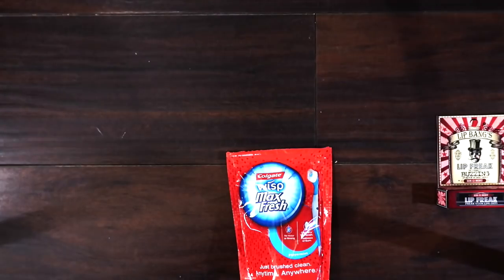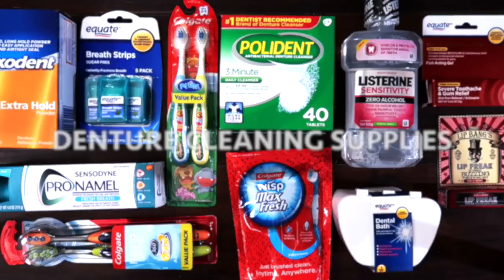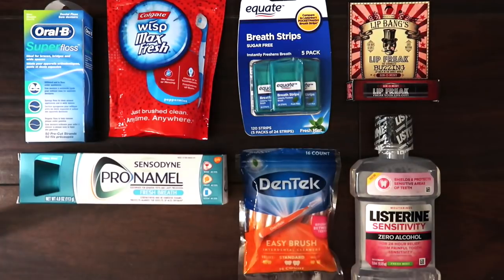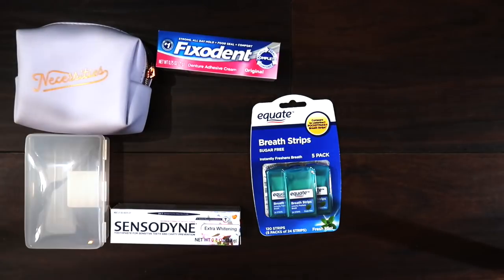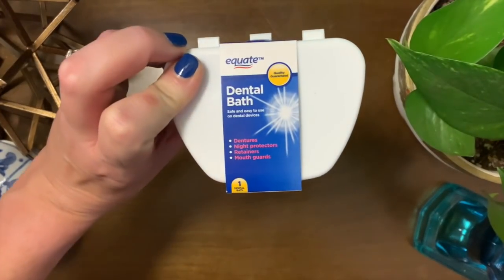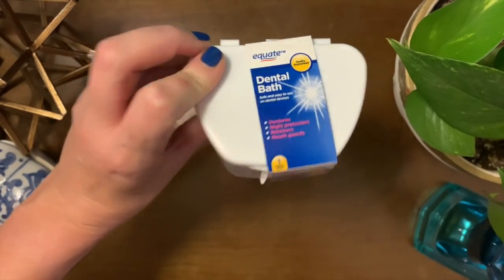I went on a shopping trip. The first thing that I picked up was a dental bath, better known as a denture bath. This is just a few bucks from Walmart.